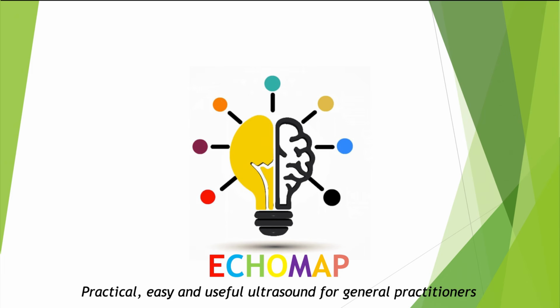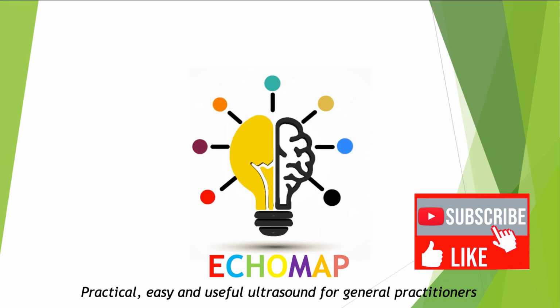Today we're talking about gynecology. So many of you have asked me for clinical cases in gynecology. Well, here you go. Here's a clinical case for you. Let's take a look at it together.